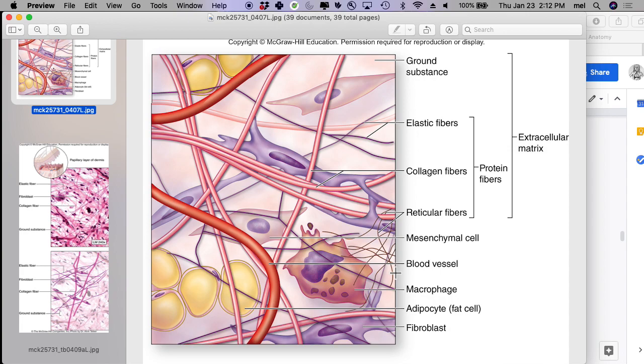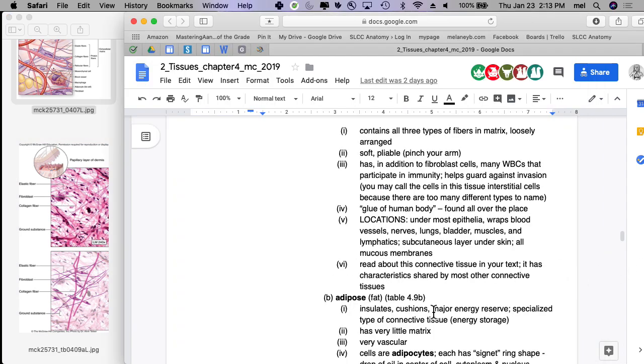And you've got room? White blood cells will move in and sort of take up residence, just in case you get exposed to something. Isn't just deep to any epithelial tissue that's exposed to the outside of the body a fantastic place to put a white blood cell? Right? It is. It's a fantastic place. So you're going to run into those sometimes. Every once in a while you get adipose in there, and we'll talk about those later.